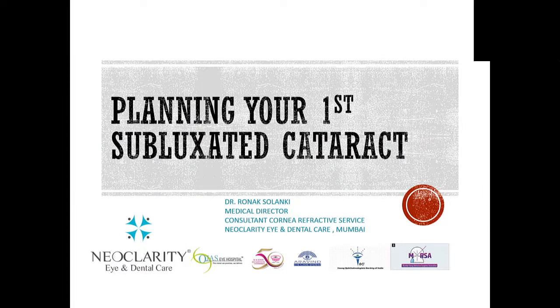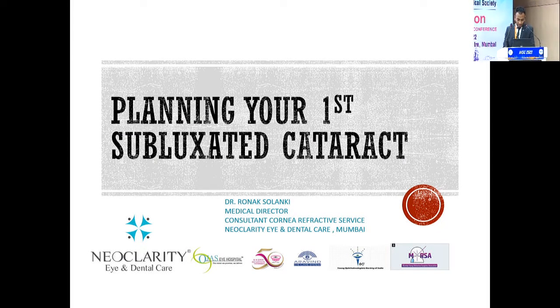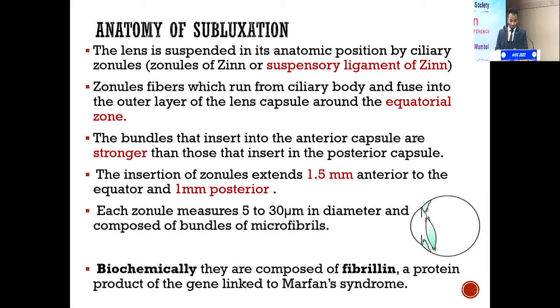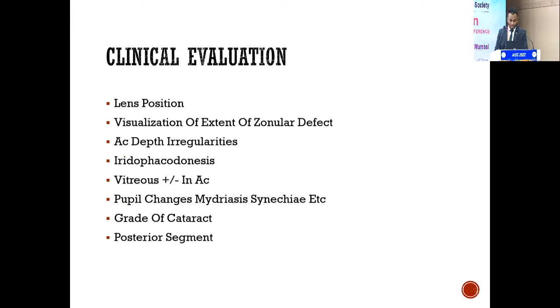Hi, good morning, everyone. I'll be presenting how you would go about doing your first subluxated cataract. I won't bore you with the anatomy, physiology, definitions and the devices used, because by the time you're planning this, you must be quite familiar with it. Anatomy you need to know, because it helps with planning the surgery and the small steps which may be helpful.